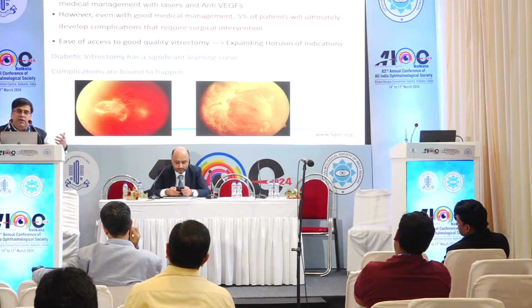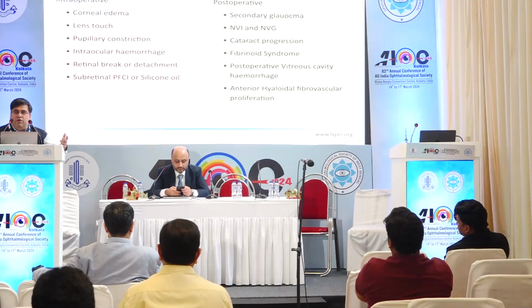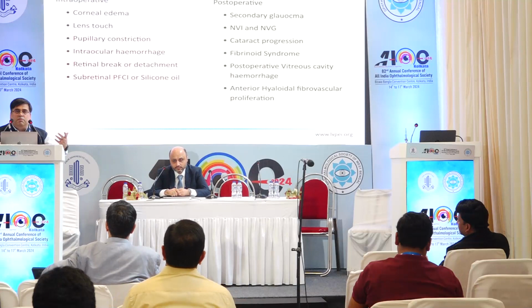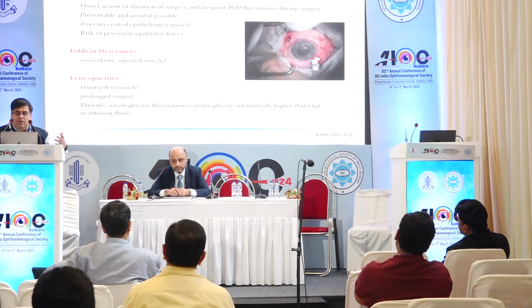Initially in your practice, these complication rates are high. Slowly, as you do more and more diabetic cases, they come down. So I would broadly classify complications of diabetic vitrectomy as intraoperative and postoperative. Some of them are quite easily manageable and don't cause much of an issue, such as corneal edema.